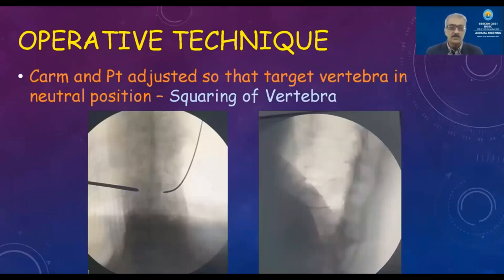The C-arm and patient are adjusted so that there is squaring of the vertebra. Squaring means the spinous processes are in the center, the pedicles are in the upper one-third of the body, the endplates are parallel in the AP view, and in the lateral view there is superimposition of the pedicles.